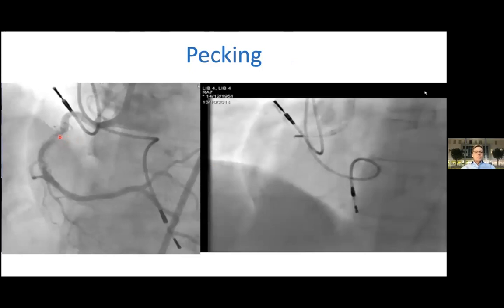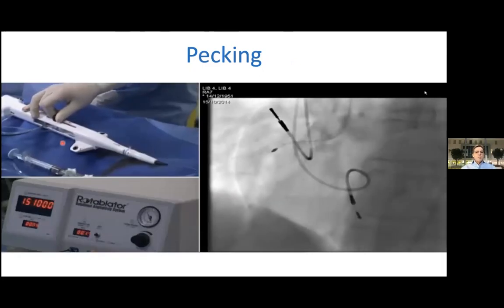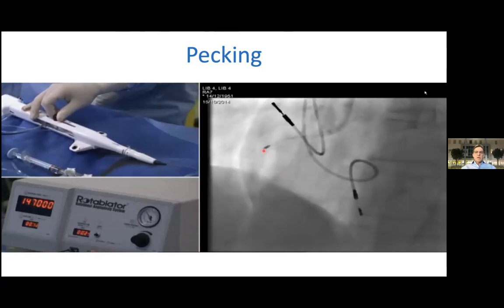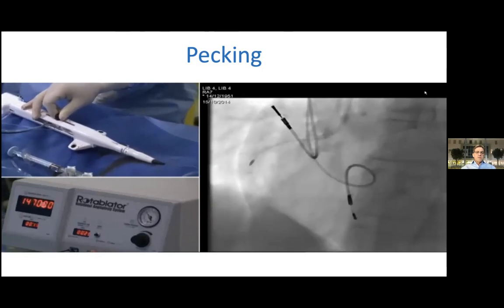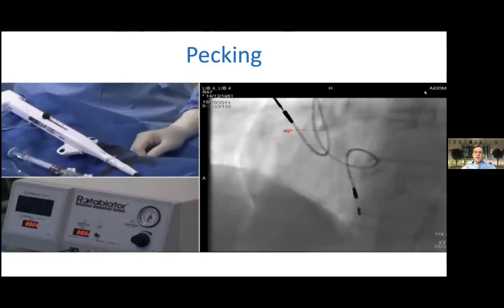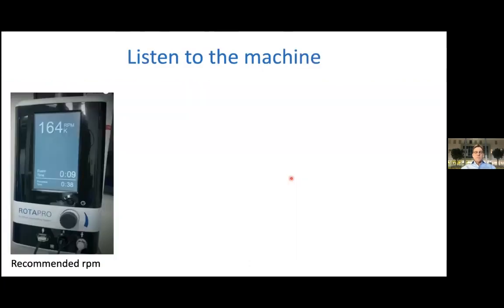And then this is a bit of an old slide, but still working, showing the pecking. We're after this heavily calcified short lesion in the right coronary artery. And we've done this recorded. You can see me here moving the advancer slowly. This is the response on the right hand. You go in, you wait a little bit until the RPMs decelerate, and then you come back, and now we've pushed through, and we've done already our job here. And now we parked the rotablation burr in a safe position where there is no stenosis.